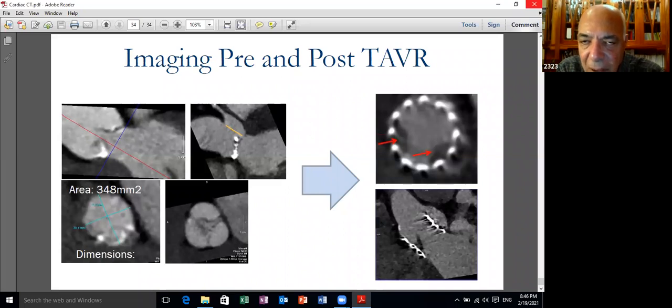It depends on the amount of velocity of conducted waves from the aortic root to the bifurcation of the aorta. So CT is an imaging modality, it is not a modality for testing the function of the aortic wall. So I don't think it's used for aortic stiffness, but it's used for aortic calcification and aortic anatomy.